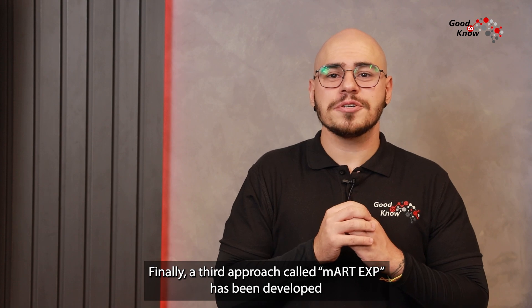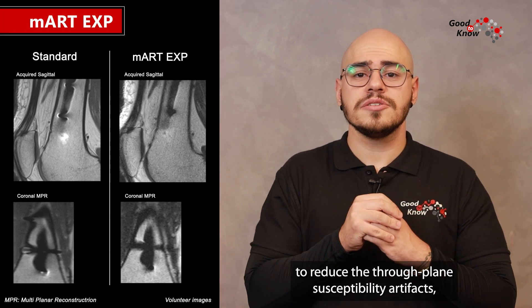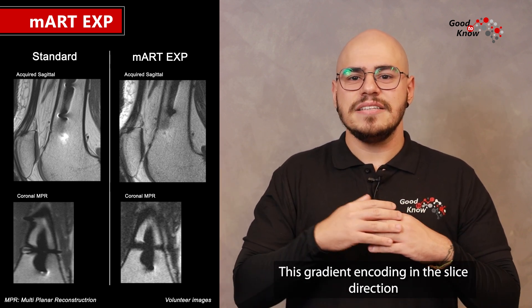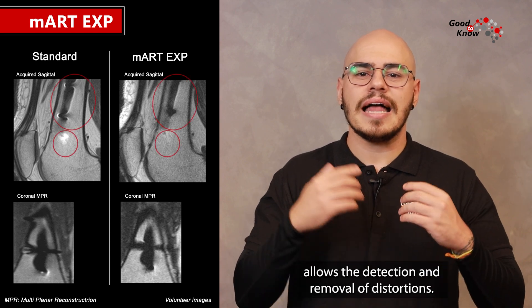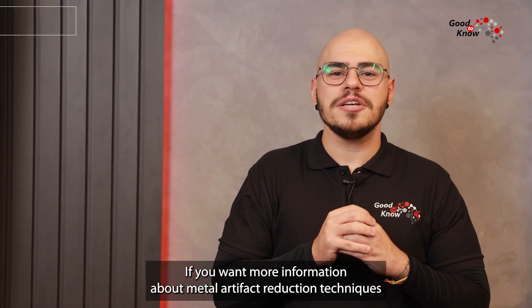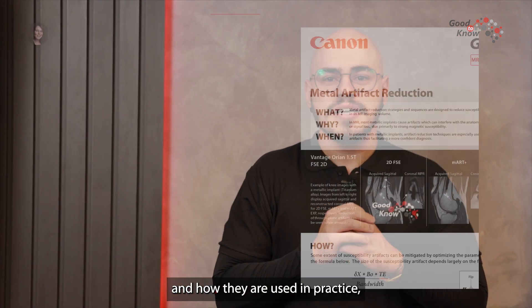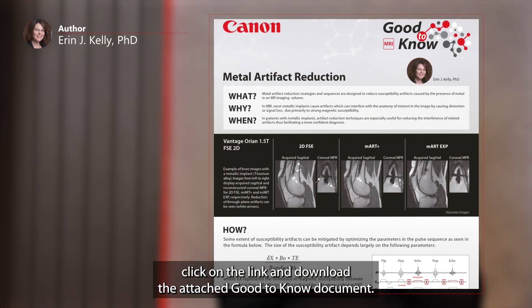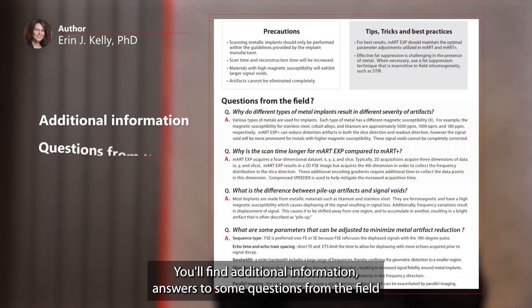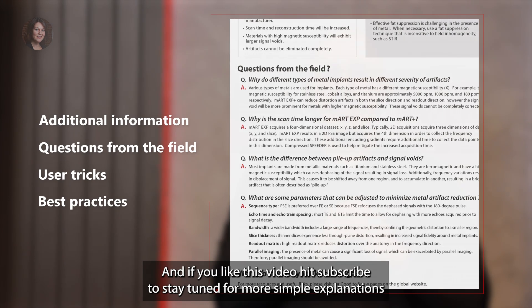Finally, a third approach called EMART-EXP has been developed to reduce the true through-plane susceptibility artifacts using a fourth additional gradient. This gradient encoding in the slice direction allows the detection and removal of distortions. If you want more information about metal artifact reduction techniques and how they are used in practice, click on the link and download the attached good-to-know document. You will find additional information, answers to some questions from the field, user tricks and best practice.